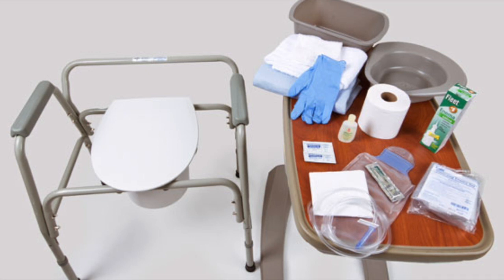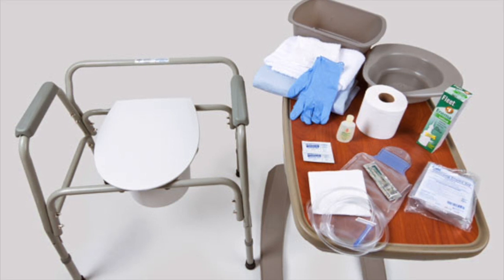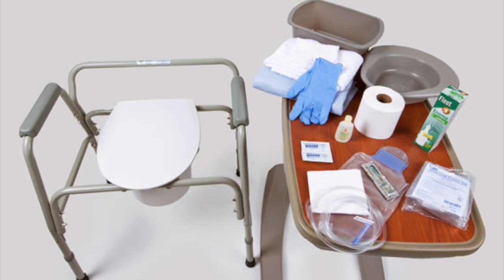If using a bedpan, use clean gloves and help the patient to as near a normal position for evacuation as possible. In this case, squatting would be the best position for your patient. Next, observe the character of the stool and solution and ask the patient not to flush. You want to ask your patient not to flush because it determines if the enema was effective, so it's important that you observe the stool and the solution.